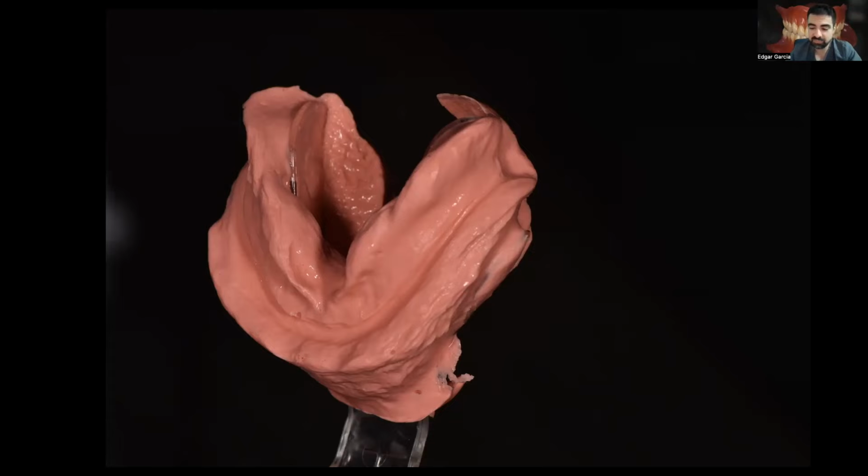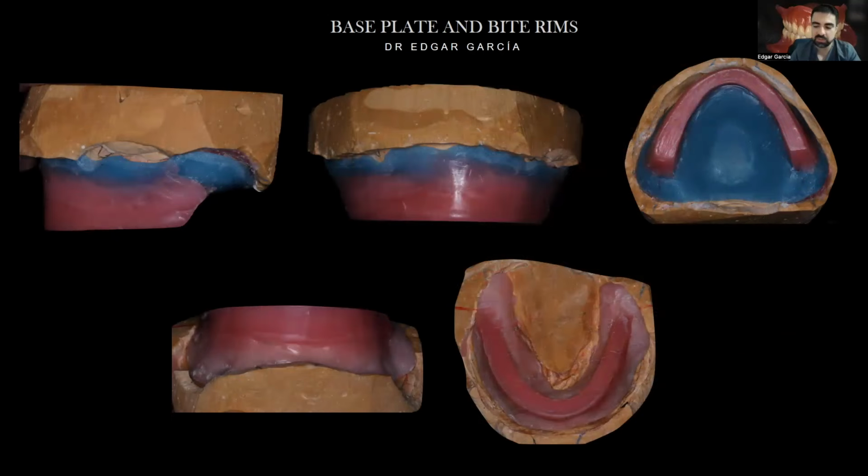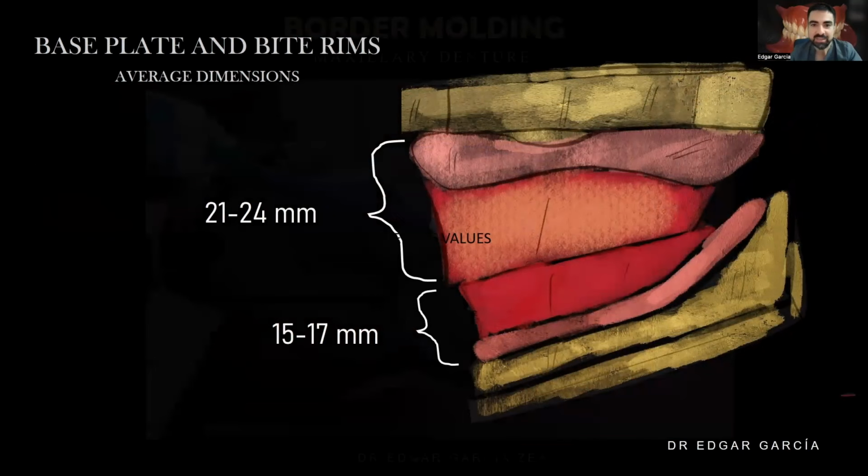So after that, at the second appointment, we are going to make some base plates and bite rims to take the impressions. Because, as I told you before, we need to take the lower impression with the mouth closed. So we make a base plate with bite rims before the second appointment. We do the average values for the thickness of the wax. Yep. Exactly. And we're going to do the border molding.